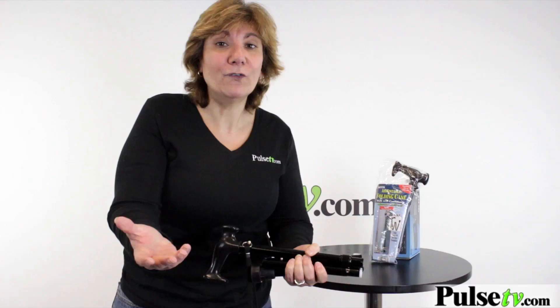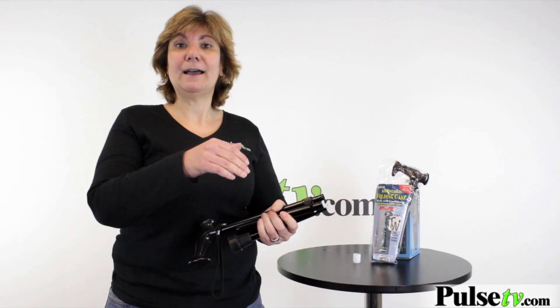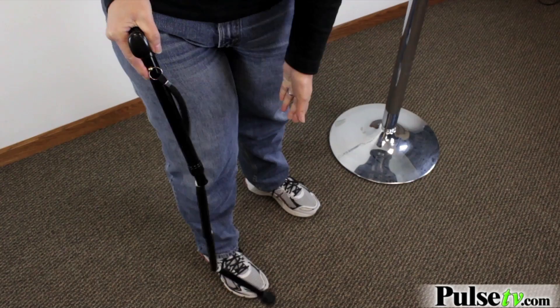And then for travel, it's great. Put it in your purse, put it in the seat pocket in front of you in an airplane. So many different things. And then when you want to use it, you just unfold it. You can feel confident that this is going to support you.